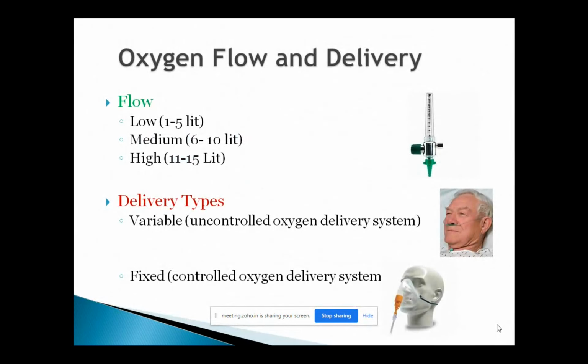I really want you to focus on this particular slide, please. First, we will talk about the oxygen flow. Then we will talk about the delivery system. On the right-hand side of the slide, you have the flow meters. The flow meters commonly used in hospitals worldwide have a maximum capacity of 15 liters. That's the reason on the left-hand side I stopped at 15 liters, because that's the very common flow meter used throughout the world.